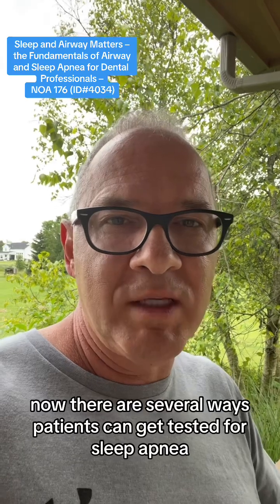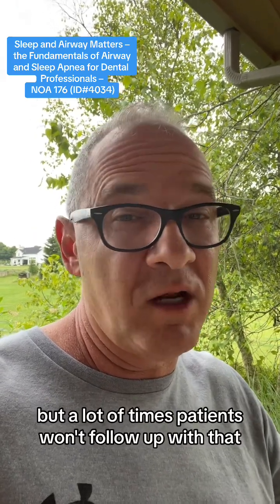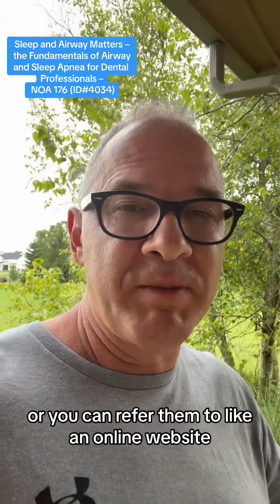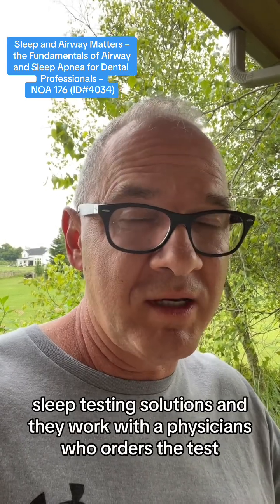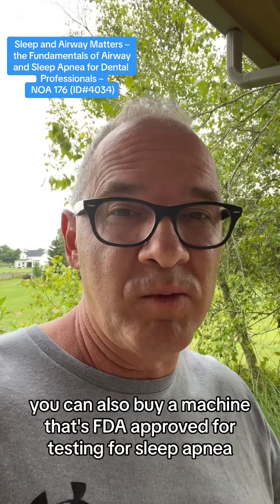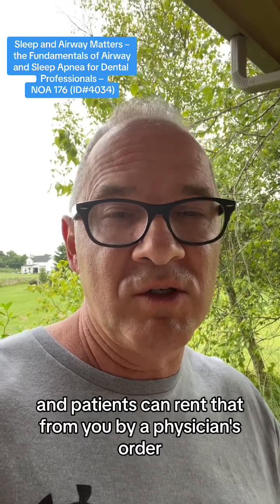Now, there are several ways patients can get tested for sleep apnea. They can either go to their physicians, but a lot of times patients won't follow up with that, or you can refer them to an online website, for example, sleeptest.com. They do offer sleep testing solutions and they work with the physician who orders the test. Or if you have a physician's order, you can also buy a machine that's FDA approved for testing for sleep apnea, and patients can rent that from you by a physician's order.